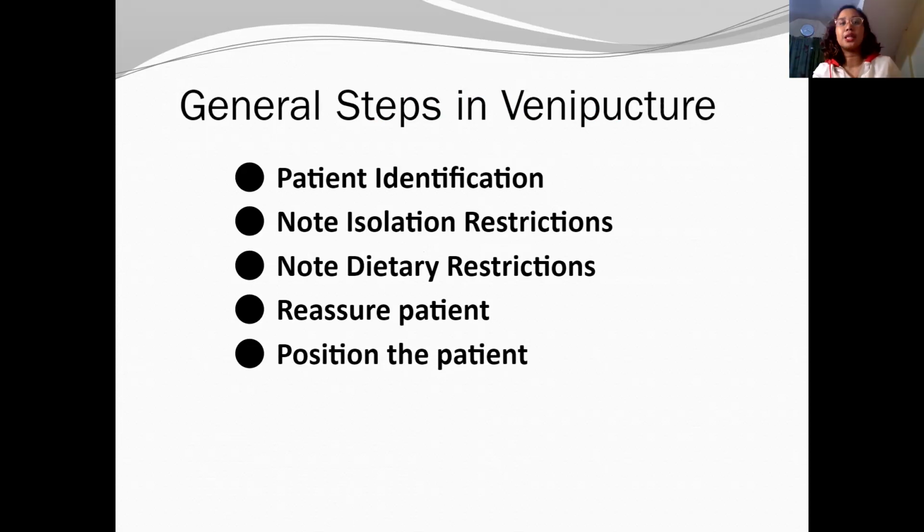Position the patient. Positioning is not only for the patient, but also for you. Every time you extract, watch your back and your neck, so that you are also comfortable. We are not martyrs.